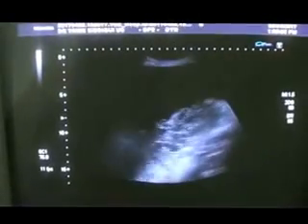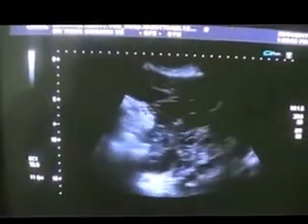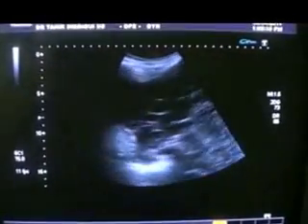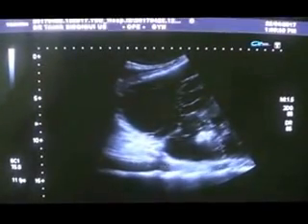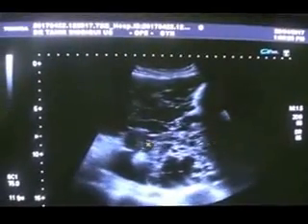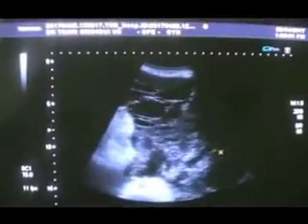Now this is a huge cyst. It extends up to the epigastric region. Now here I am in the epigastric region, and you can see all septa, longitudinal section, you can see the aorta. This is the aorta. This is the cystic area. All cysts, thin, thick, all types of septas, along with debris.